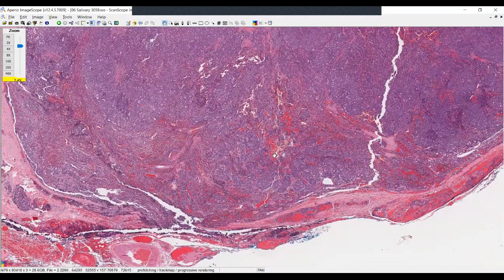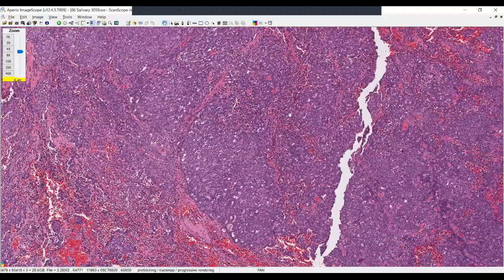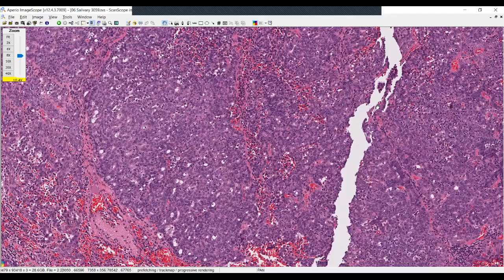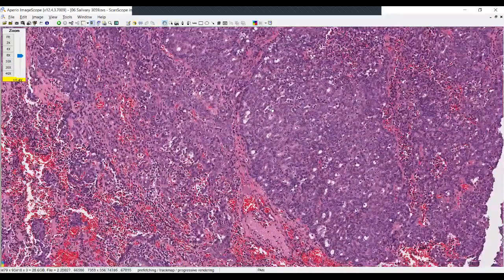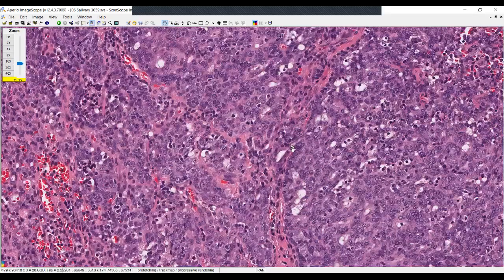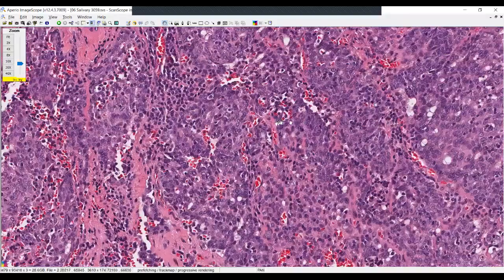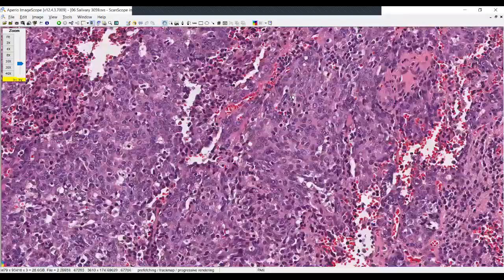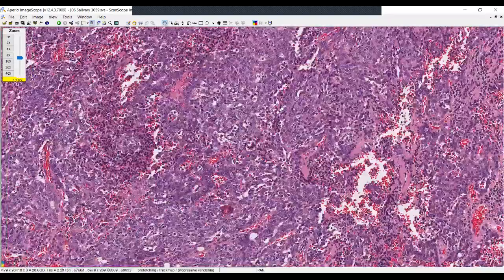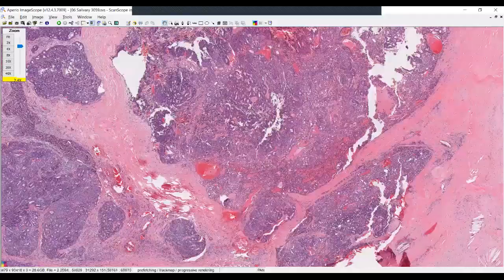So salivary gland tumors, as you know, can be remarkably variable one to another. There are more than 45 different tumor categories within the World Health Organization classification. So sometimes you just have to look long and hard in order to get a feel for what the tumor is that you may be dealing with. As I look at this, my sense is that I'm dealing with some sort of glandular proliferation. The cells are somewhat small to medium in size. And in this example area, I don't see too much in the way of nuclear pleomorphism or profound variation.